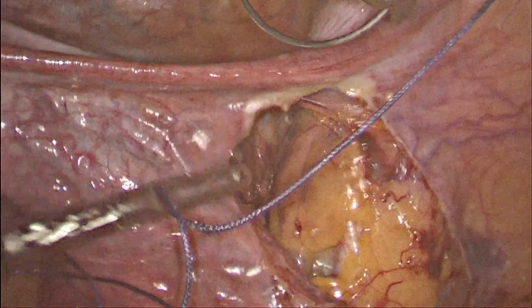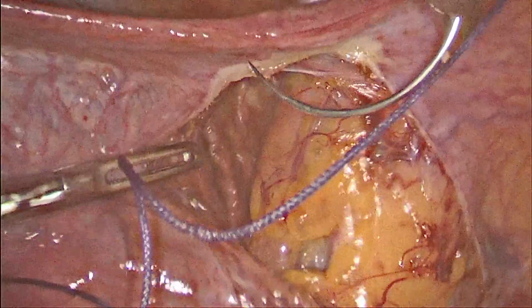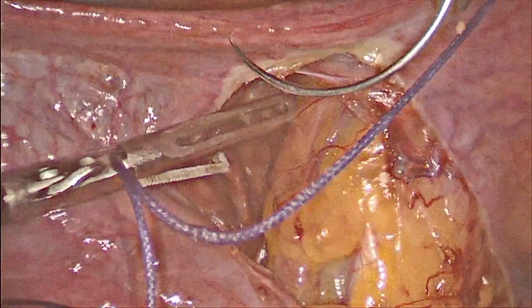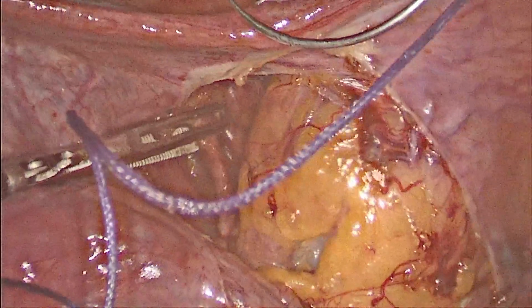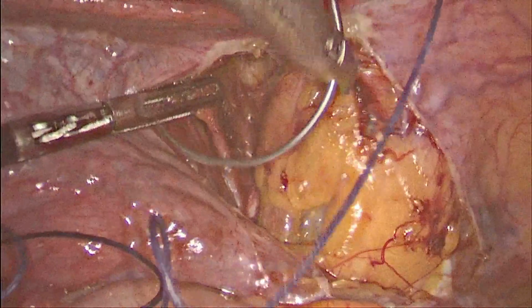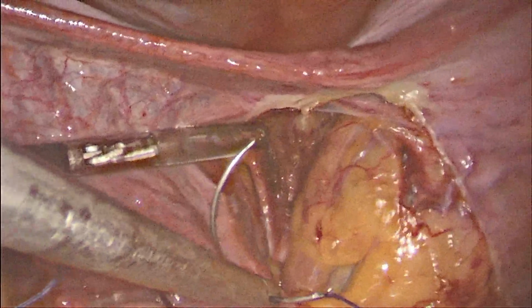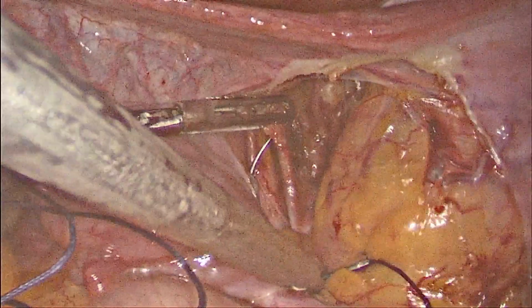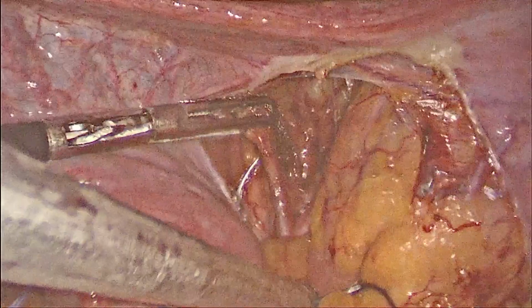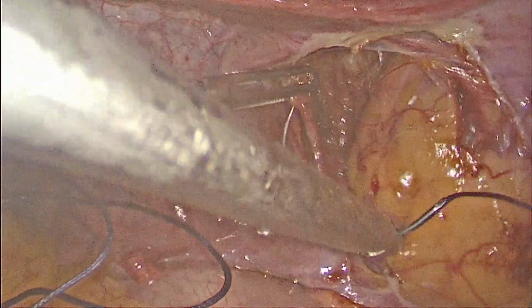So after completing the dissection, now I'm trying to take a bite through the window between the uterine artery and the vein below. It is safer to pass the suture, not the needle, below the uterine artery. But in this case, there was a little fibrosis, and we are finding it difficult to separate the uterine artery from the vein.